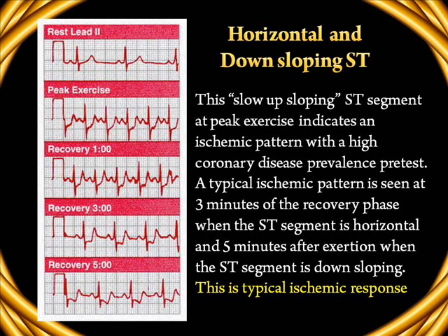So it's important for us to know if there is an ST segment depression, is it downsloping or horizontal? If it is downsloping or horizontal and persisting into the recovery and increasing with the increasing duration of the exercise, it is classical and significant of ischemic response. An upsloping ST segment depression which does not extend into the recovery phase is not indicative of ischemic response.